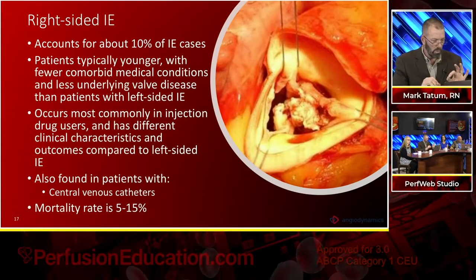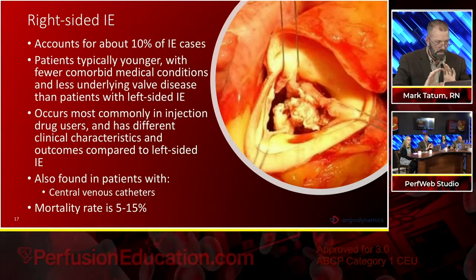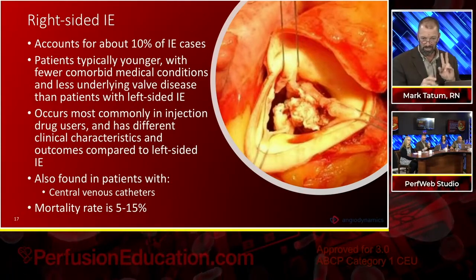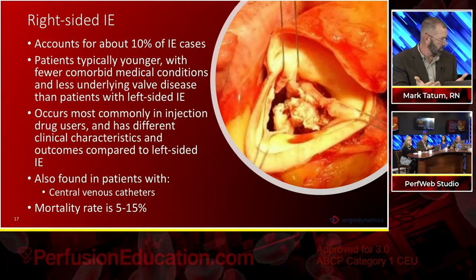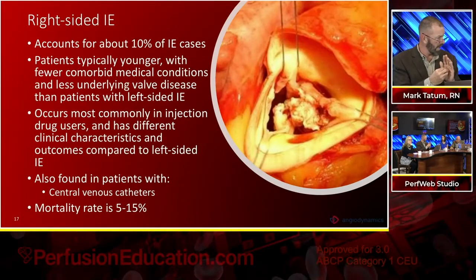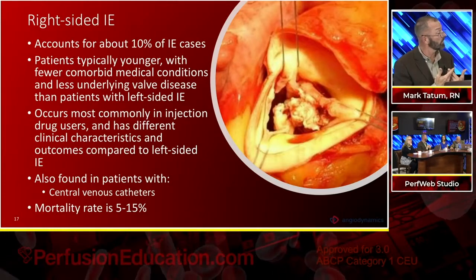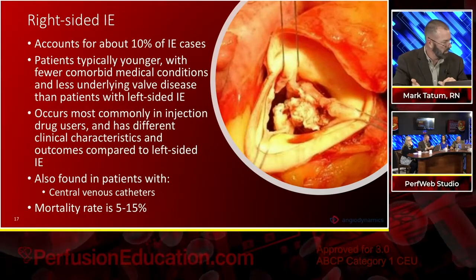With the 14 millimeter circle that we have at the end, the funnel opening, it doesn't engage all of the tissue at one time to be able to cause damage. Second, even when you're flowing at 3 to 5 liters per minute, the negative pressure on the outside of the cannula is roughly 30 to 40 millimeters of mercury negative. It isn't until you actually occlude the cannula that you get the really high negative pressures that can remove the material in the first place. So damage to the valve as a result of the utilization of the cannula isn't what we see.